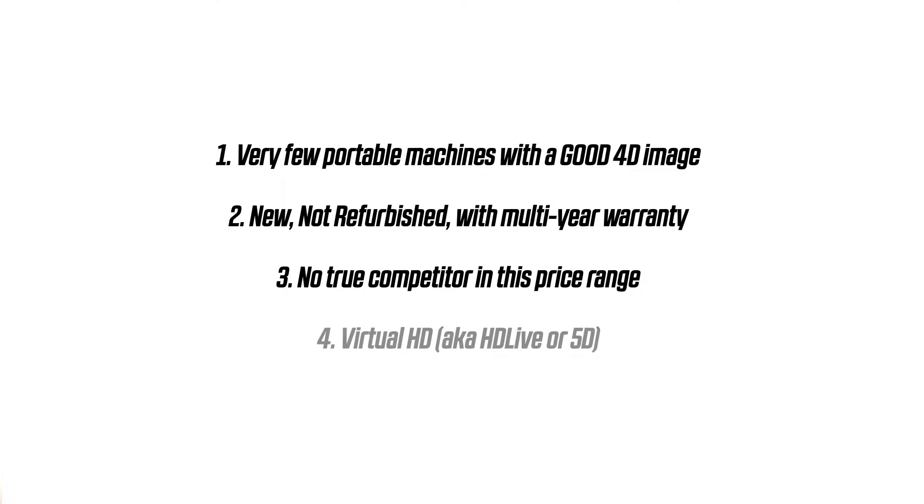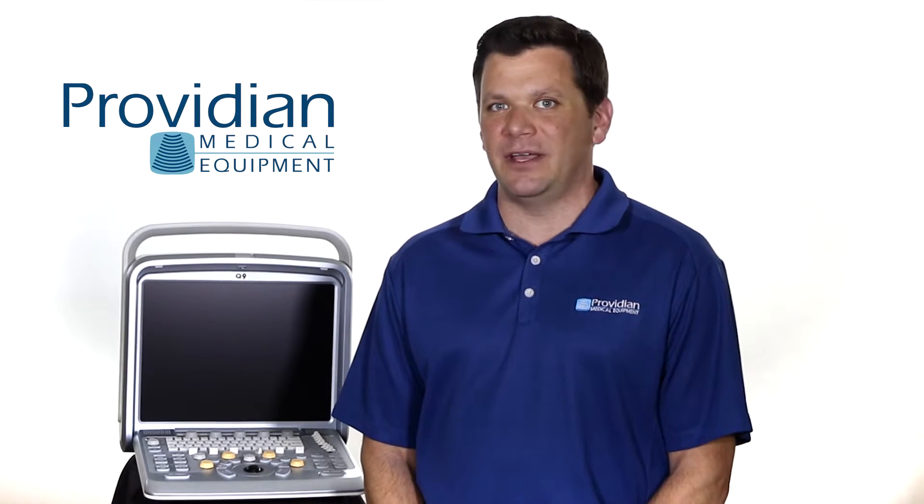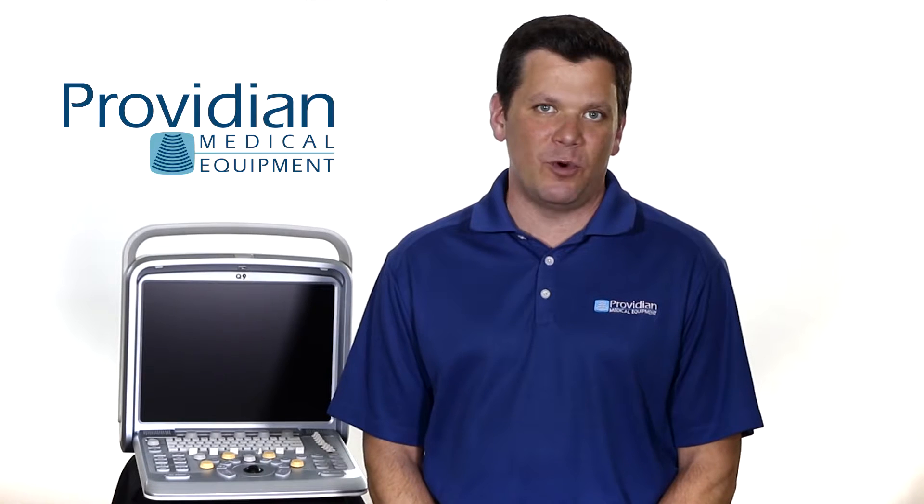Four, it has Virtual HD, also known as 5D or HD Live, and it can be really cool or a little creepy. The only competitor here really is the GE Voluson i, but to match the similar price you have to purchase the Voluson i refurbished, and you don't get an extended warranty.